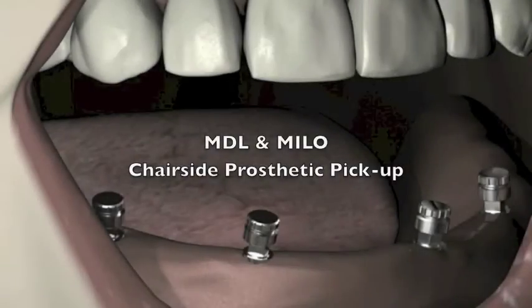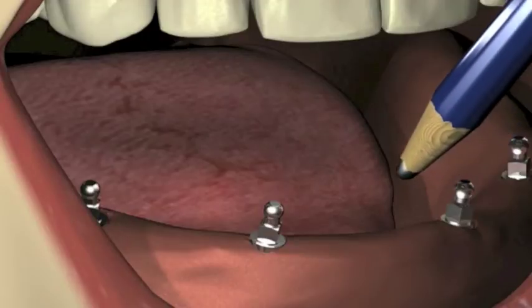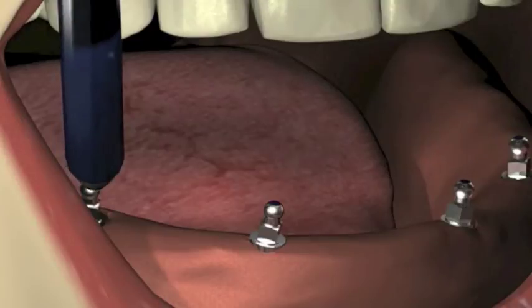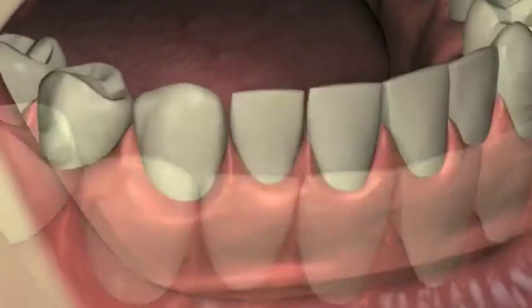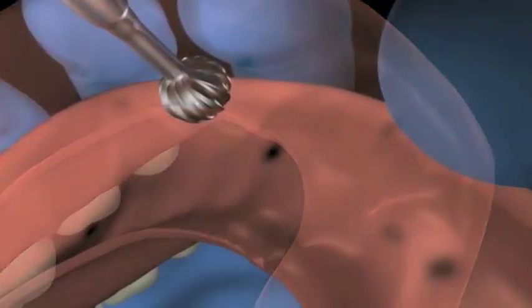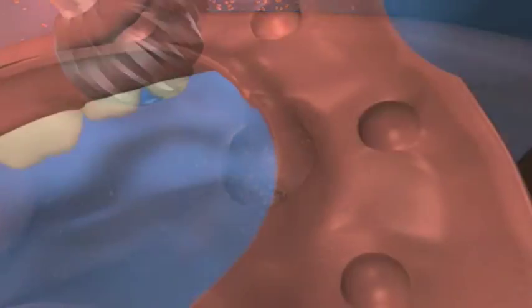For chair-side pickup of the denture retentive component, transfer the position of the O-balls to the tissue-bearing surface of the denture by marking the heads of the O-balls with a lead pencil, or insert soft silicone or soft wax inside the denture. The location of each implant is transferred to the denture. Using a resin burr, relieve the opening around the abutment impressions or markings in the denture by approximately 5 millimeters.